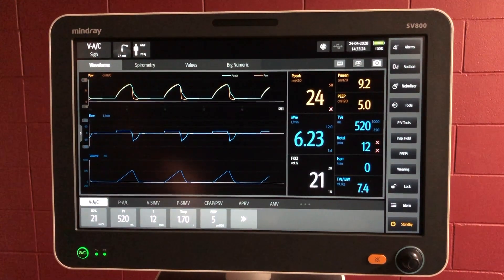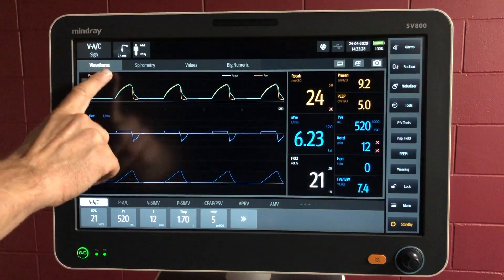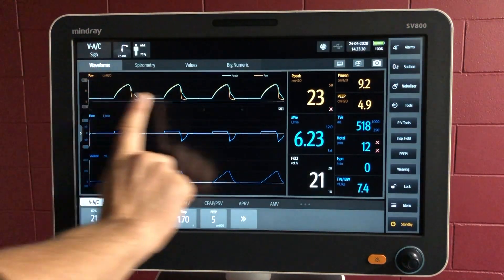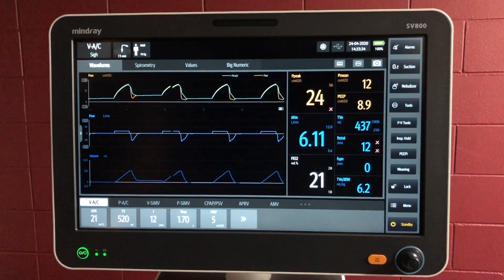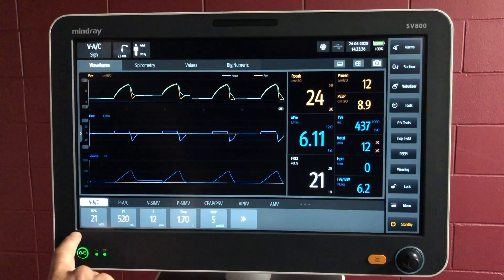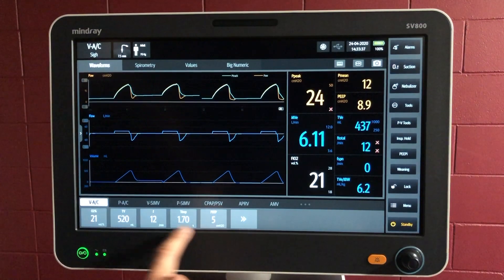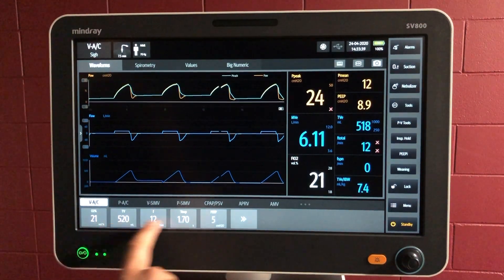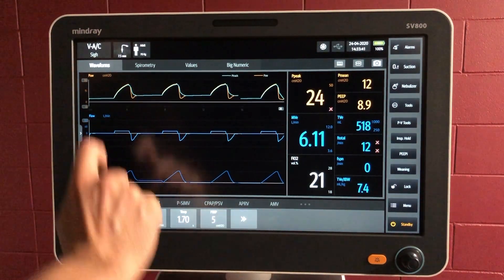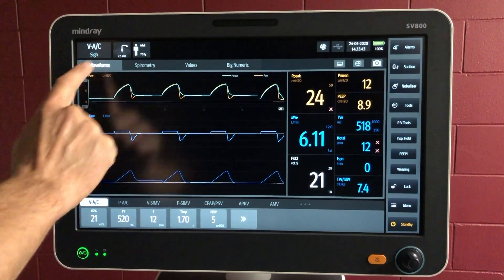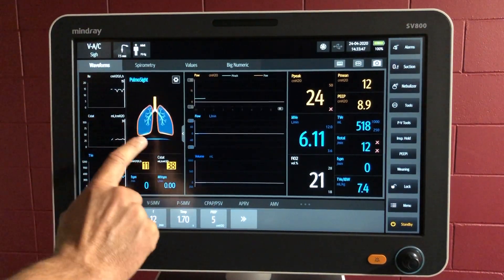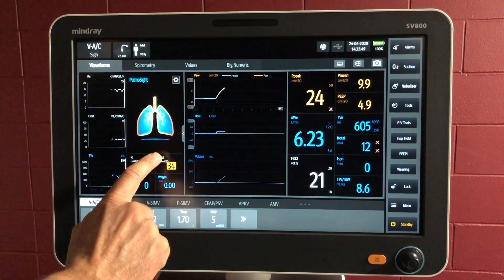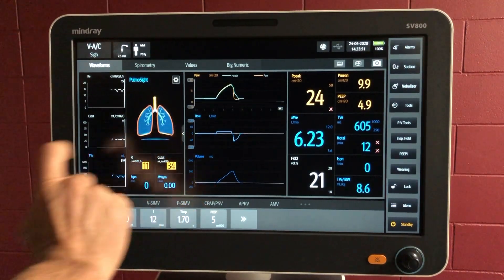Let's have a look at some viewing options of the main screen. As a default we've got the waveforms tab open, which gives you a large amount of surface area to view the waveforms, with the readings over here and the settings underneath. The settings will always stay there. From within the waveforms page we can pull out this PulmoSight window for lung compliance, and we can tuck it back in as well.